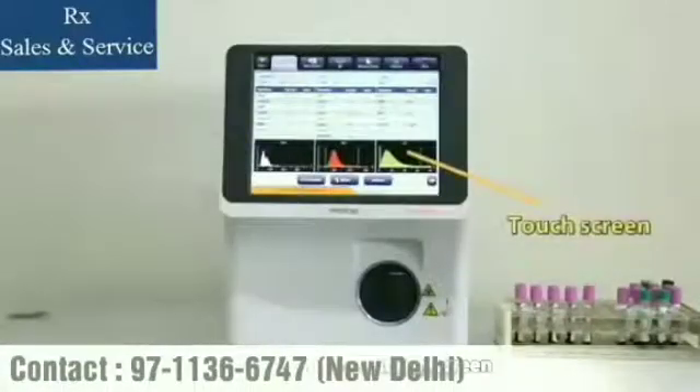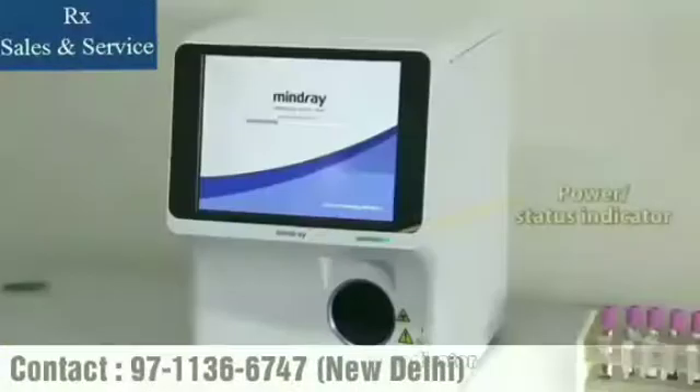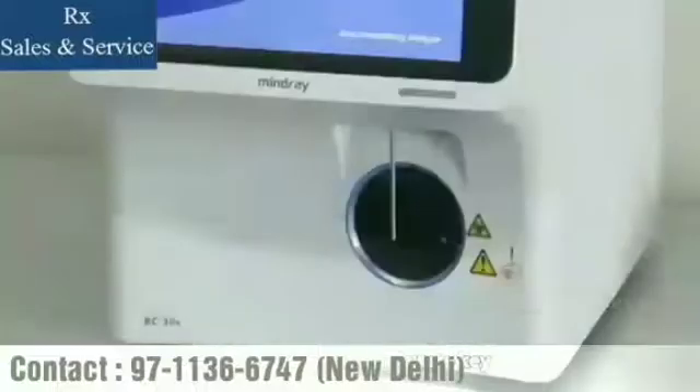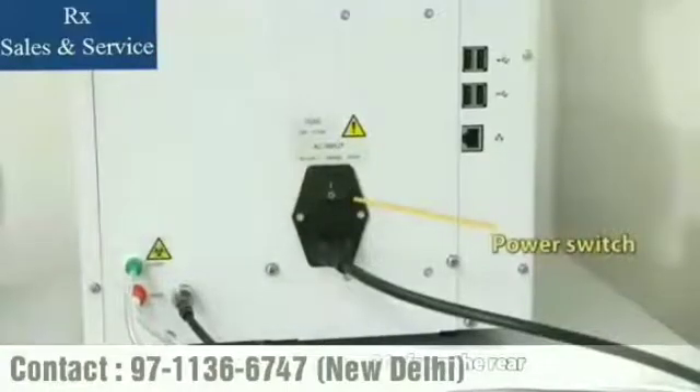BC-30S contains a touch screen with user-friendly software. The power status indicator shows the status of the analyzer. Users can load samples through the sample probe after pressing the aspirate key. You can switch on the BC-30S from the rear.